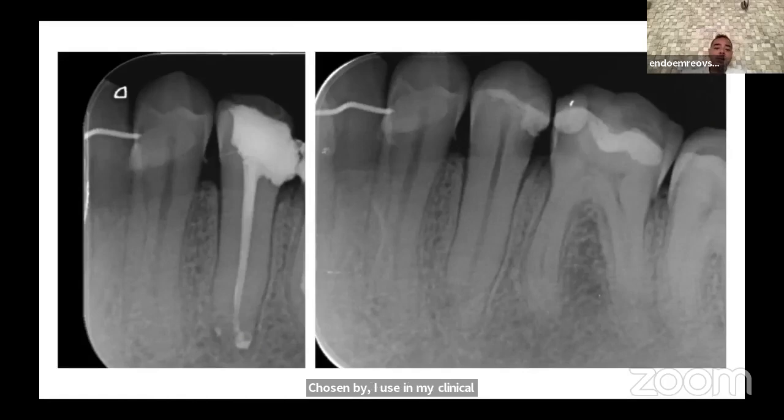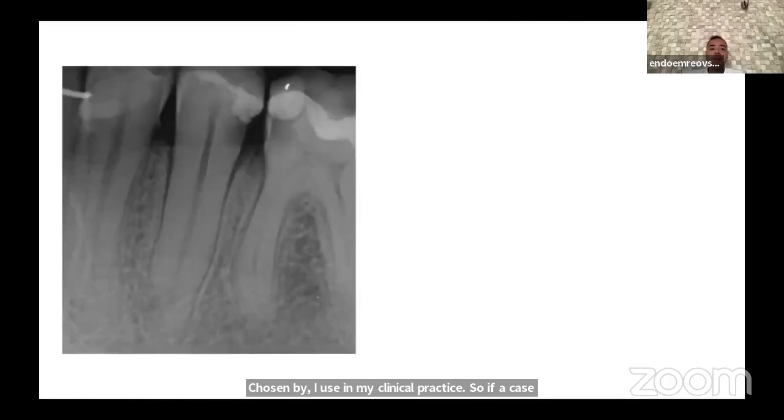So in a case like that, you need to get inside the case to understand the proper problems. When you look at this case, you cannot see the apical part clearly. This means there can be a second root canal, an apical delta, or a calcification blocking the way to reach the apical part.